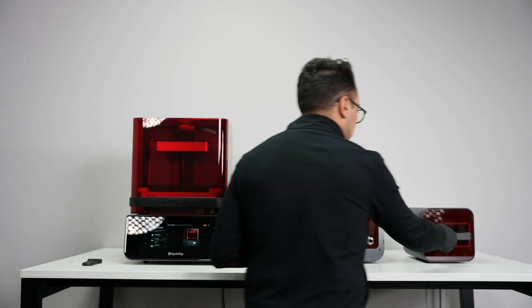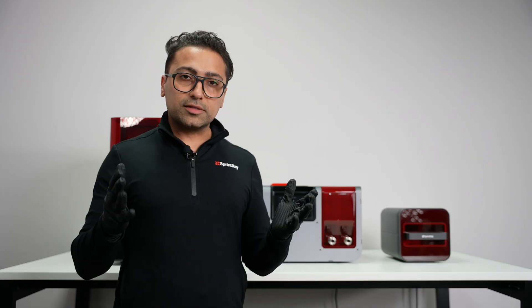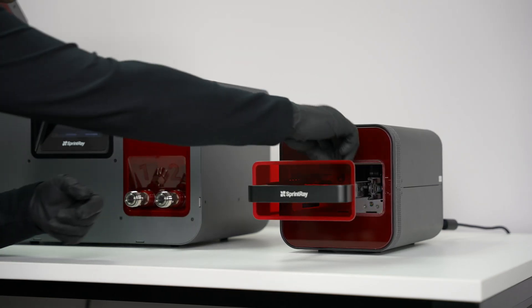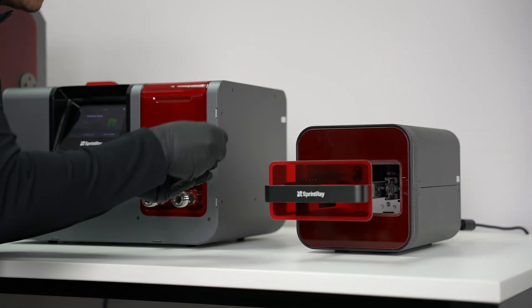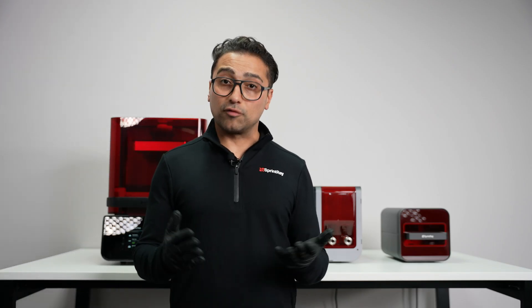Simply move it to the curing machine and start the curing process. Once curing is finished, remove the medical device from the curing machine. Congratulations on your first print.